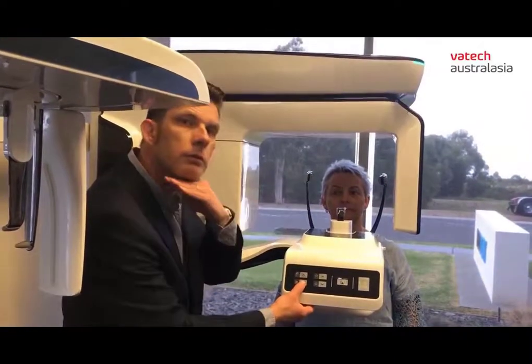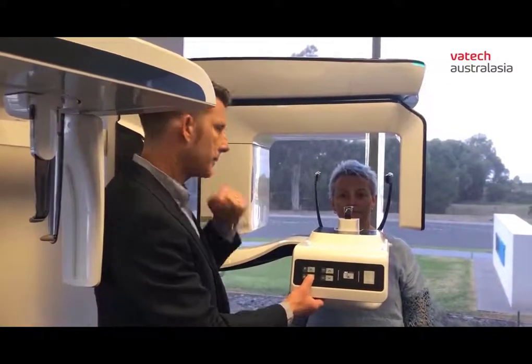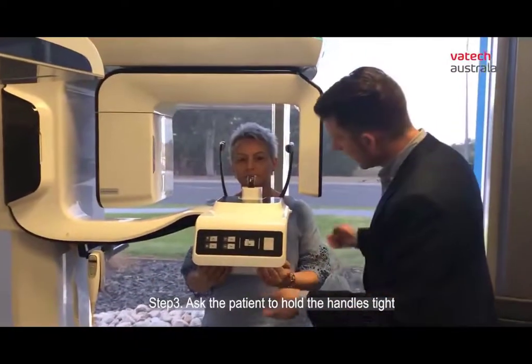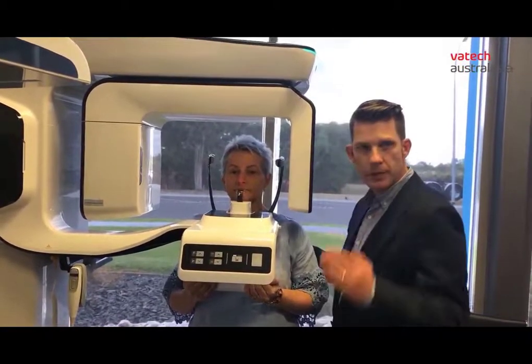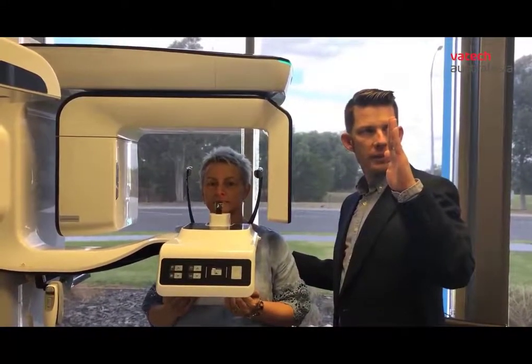I'm going to look right below the patient's chin, because this time I'm looking for more of a natural head position, so their head is slightly tipped down. I'm going to say we're going to go right in there. Hold on to the hand rest here, and walk forward until your feet hit mine. You might feel like you're leaning back a little bit, but that's what I want. This time I want their body not perfectly vertical, but several centimeters forward of center.